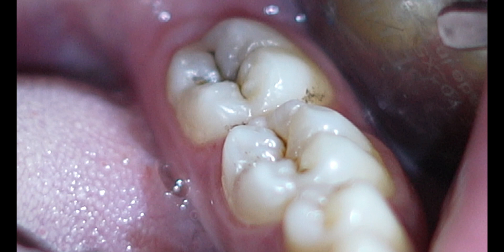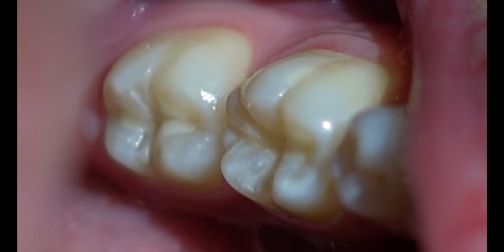Coming to the aesthetics, they are very superior and the translucency of the restoration is outstanding — better than any other filling materials. Let's have a look at this lower first and second molar. This is the pre-operative picture showing carious lesions all around the grooves, and this is the post-operative result. The restoration with Equo40 HD — I am amazed with the brilliant aesthetics.